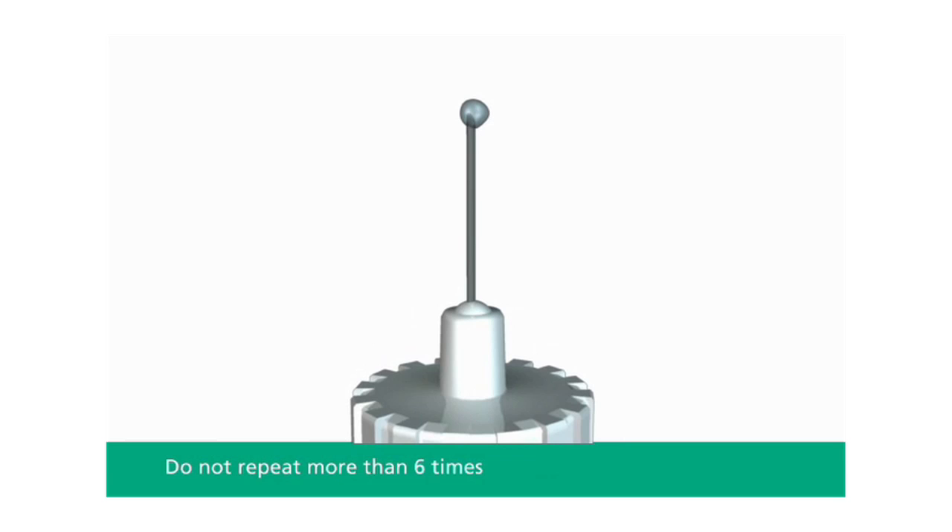If you do not see a drop of insulin after six times, do not use the Levemir FlexPen.